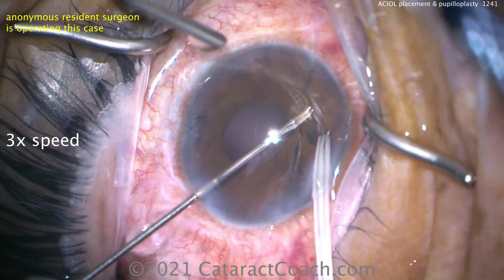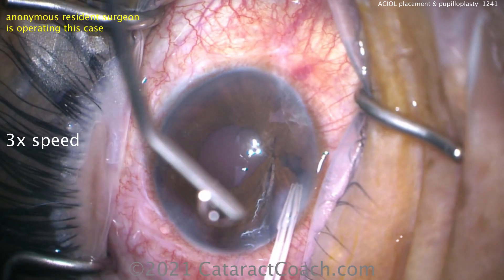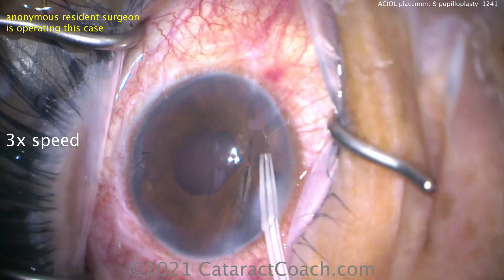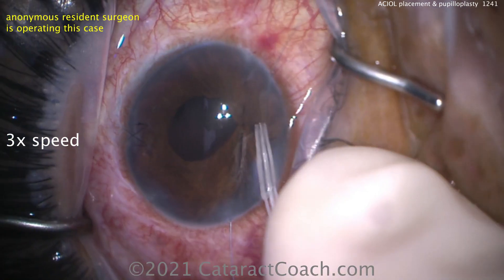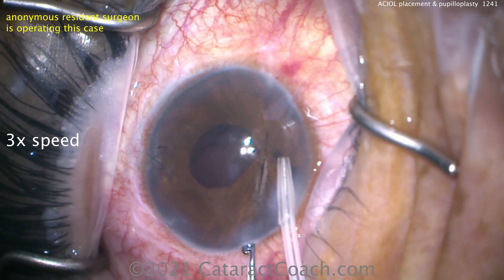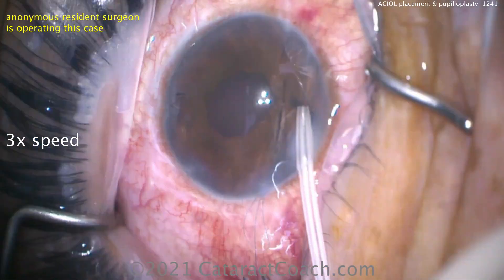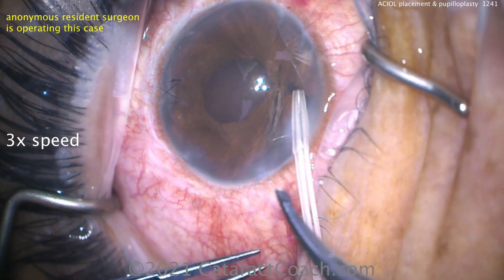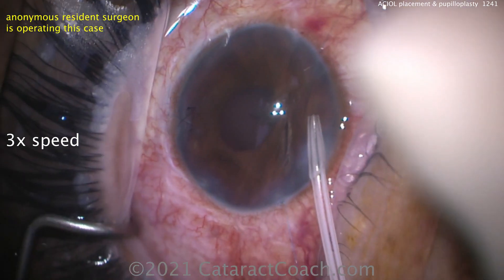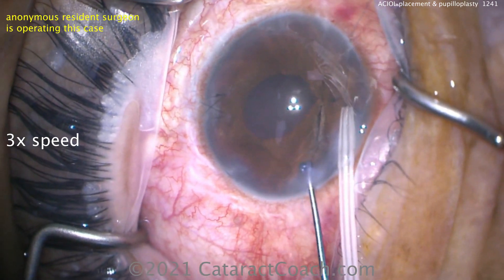Let's talk about AC lens power selection. It relates to the A constant of the lens. If our in-the-bag calculation is a 20-diopter lens for plano, and we put in an AC lens, we need to look at the difference in A constants. Our calculation was an A constant of 119.2 calling for a 20-diopter lens. The AC IOL has an A constant of 115.7. So 119.2 minus 115.7 is a difference of 3.5. The IOL power for the AC lens must be 3.5 diopters less — so 16.5 diopters for the AC lens.